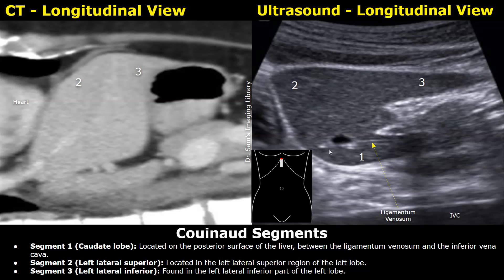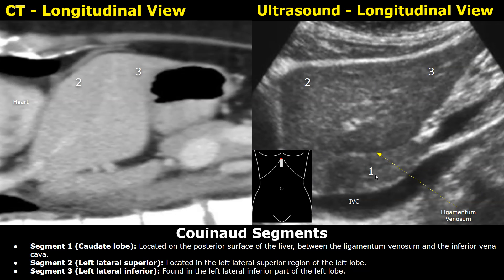Down here you see a hyperechoic bright line — this is the ligamentum venosum. Just below this white line is the caudate lobe. So in this view you will see segments 1, 2, and 3. This hyperechoic border around the caudate lobe is the ligamentum venosum, and it is a landmark for locating the caudate lobe in this view.